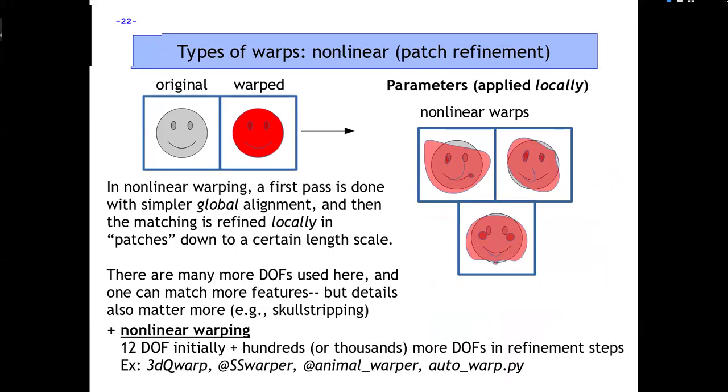And then finally, the next level up is a big change for how alignment works. Now we allow data sets not to just be a simple kind of global change of rotating the whole data set, but I allow a data set to rotate and part of it moves differently than another part. And so it kind of blobs around into what can be really quite weird distortions here that I've accentuated for the purpose of visualization. Hopefully this is not happening to much data in the scanner. But what this does is whenever we do nonlinear alignment, we start with a first pass of simpler affine alignment, so a global fit wherever the data set rotates or shears there.